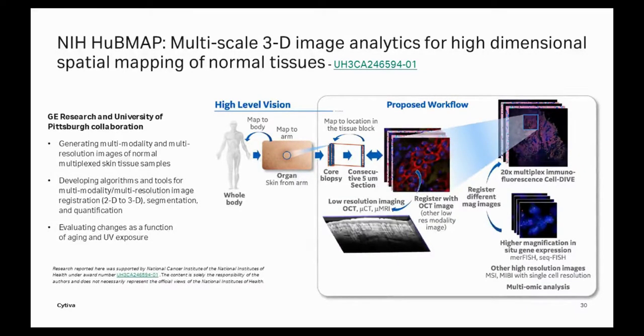And most recently, this has been a very exciting new area for us. We're working with the HubMap, part of the NIH Common Fund. And here we're looking with a large consortium. In our case, we're looking at healthy tissue. We're looking at multi-scale 3D image analytics. This is led by my colleague Yosef Al-Kafahi and Anoop Sood. And here, again, we're working with University of Pittsburgh in the dermatology department.